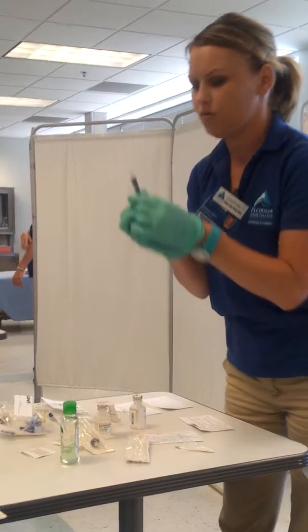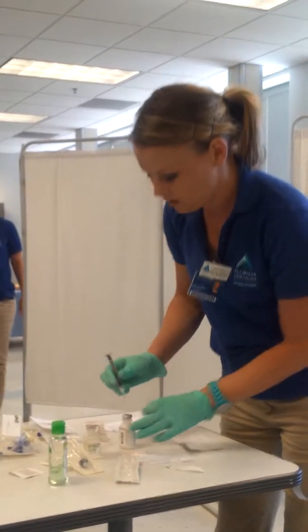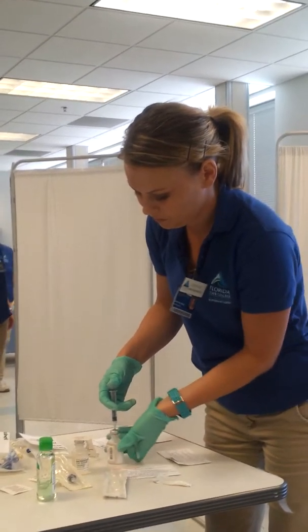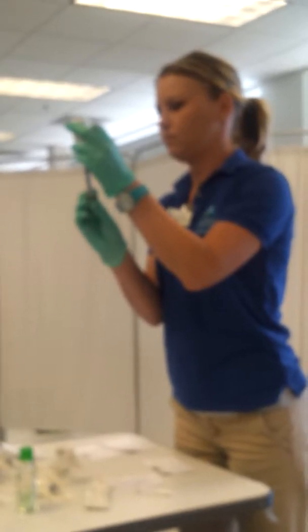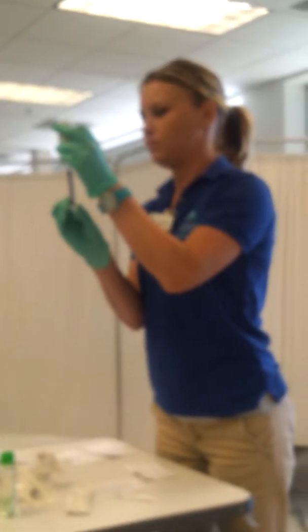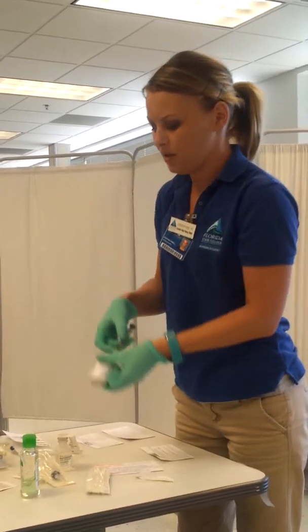I'm going to draw up half a milliliter of air and I'm going to insert this into my vancomycin. Okay, so I've got my half a milliliter of vancomycin.